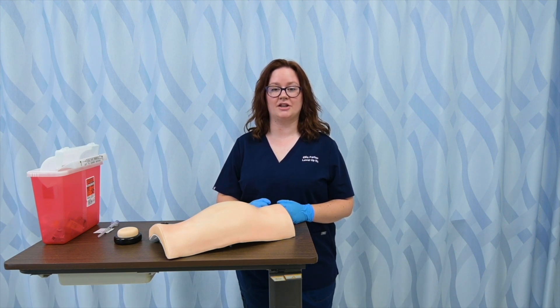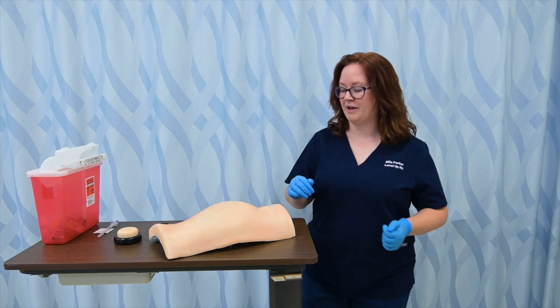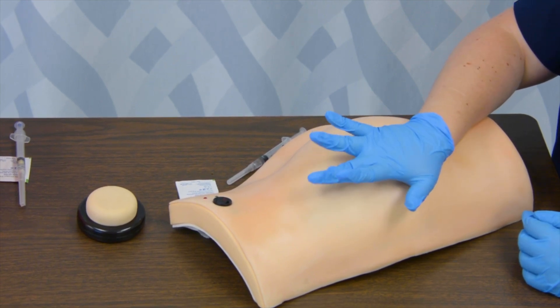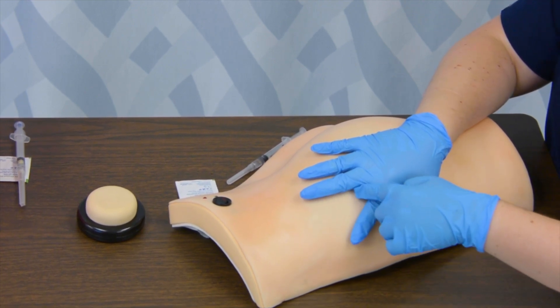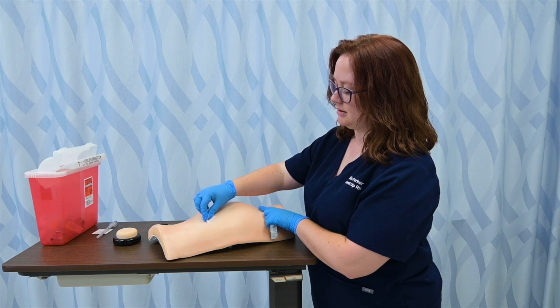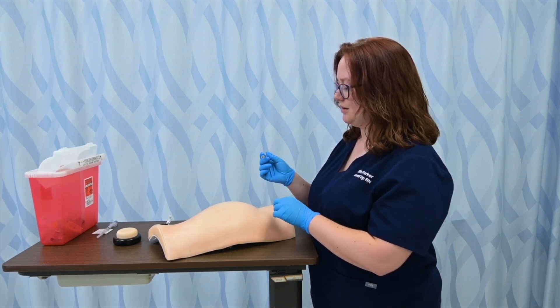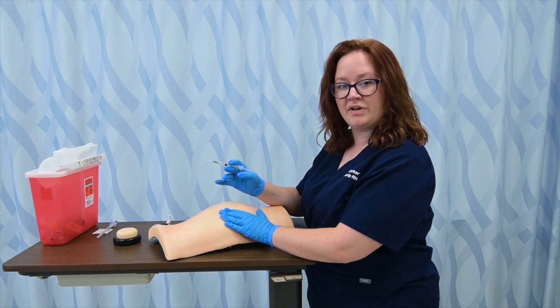My first demonstration of an intramuscular injection is going to be in the ventrogluteal site using the general injection method. I'm going to locate my site using anatomical landmarks. I place the palm of my hand on the greater trochanter, point my middle finger straight up towards the iliac crest, and dip my index finger forward towards the groin. This creates my triangle of safety — that's where I want to inject. I then get an antiseptic swab, clean in concentric circles, and as that's drying, I grab my syringe and needle with about a milliliter of medication drawn up. I pull the skin taut so it's not moving while I go for the injection.